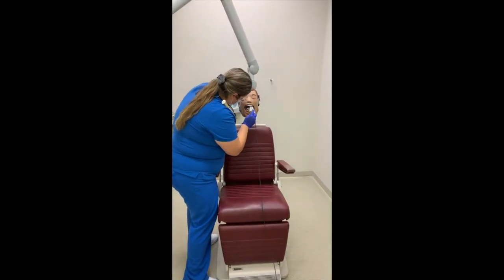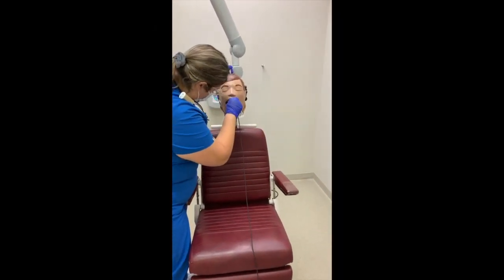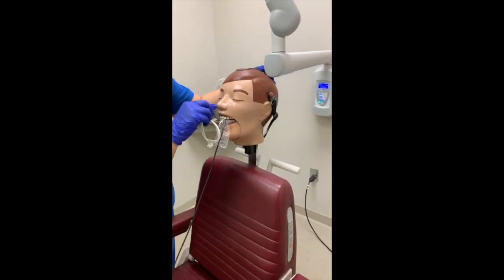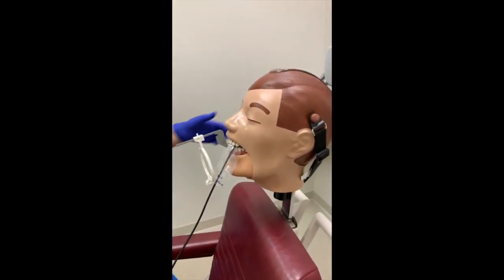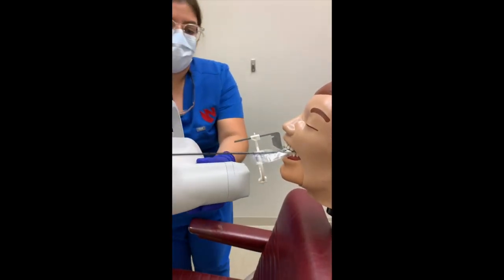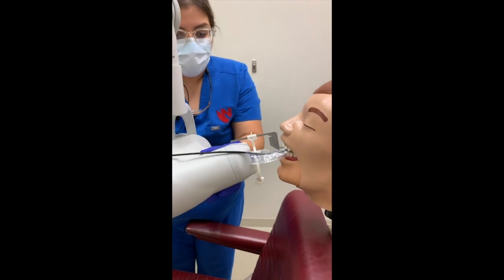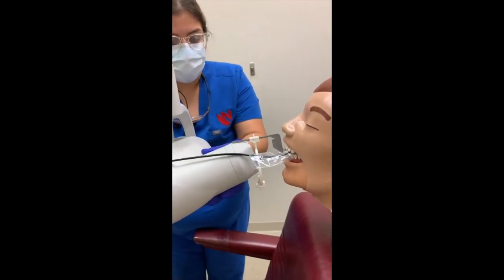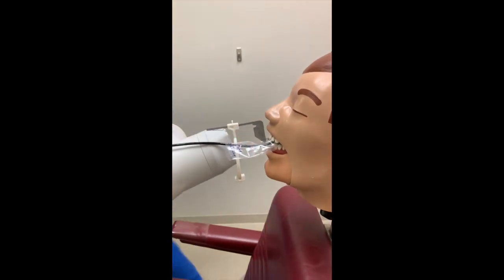In our first example, the student is attempting to capture a PA of the mandibular incisors. The student places the anterior PA setup using the paralleling technique, where the sensor is parallel to the long axis of the tooth. After moving the aiming ring toward the patient's face, the student positions the tube head and position-indicating device parallel to the beam alignment device to expose the image. When reviewing the captured image, all four mandibular incisor crowns and roots are visible, but no apices are seen.